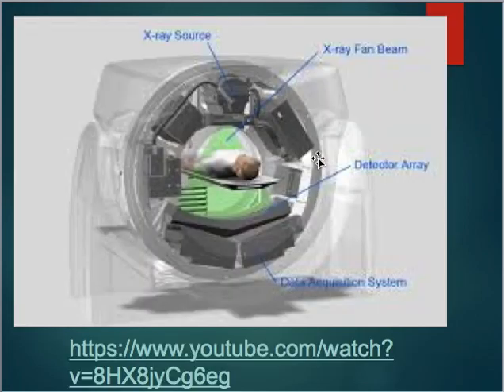There's actually a video on this next slide. If you want to click on this hyperlink, you can, and it will show you a video of how the CT machine scans. They take the cover off, and you can see it rotating around the patient and how it really would. So again, here's that detector. This one gives you a little idea of the patient on the table and the x-ray tube and the beam coming out. So you can see this green beam is coming out. And it would do that continuously as it rotates around the patient.